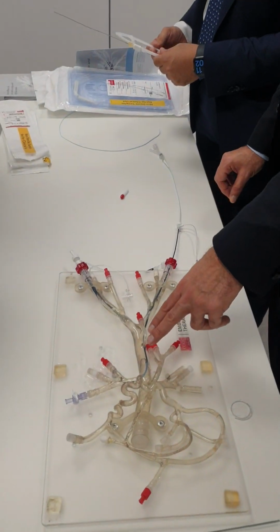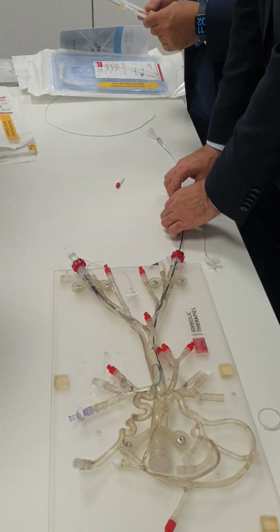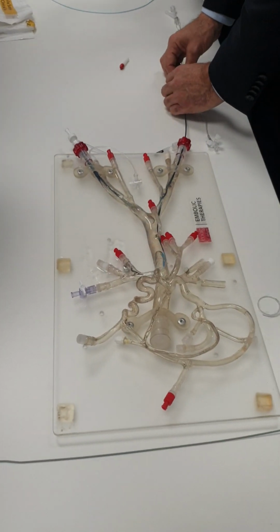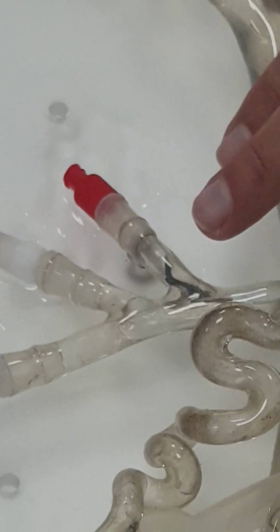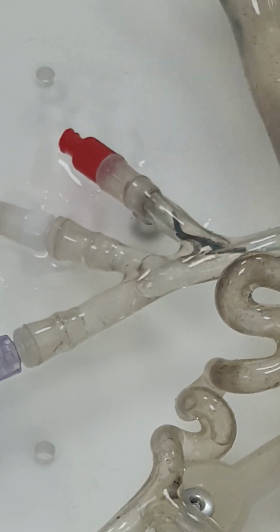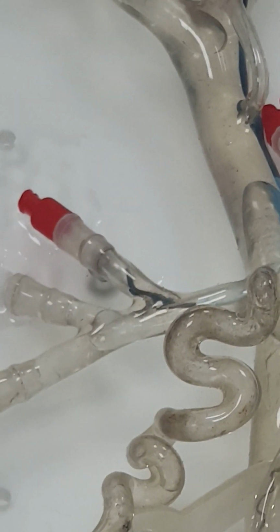What is the important thing if you are embolizing the vessel like this? To have your catheter inside the vessel in a secured position, nicely inside it to control the deployment of the coil. Not very close to the origin. You want to avoid unnecessary or non-target coiling. To unlock it and push it like this inside the catheter.